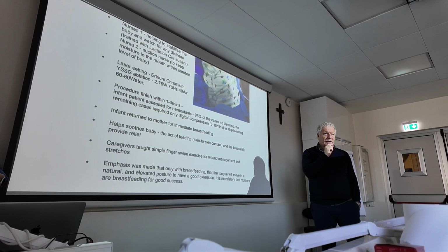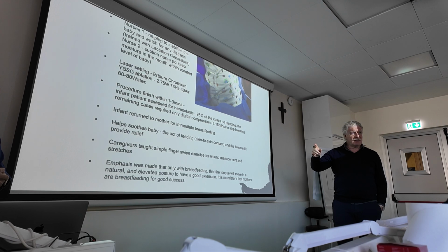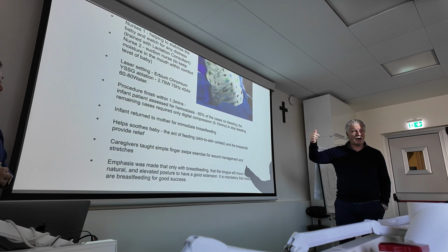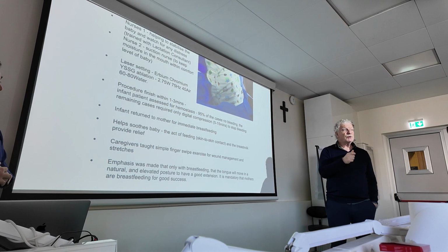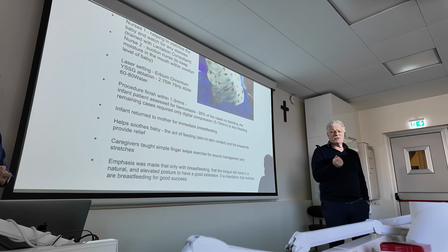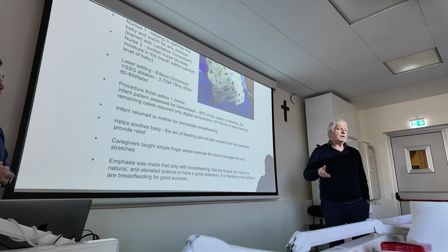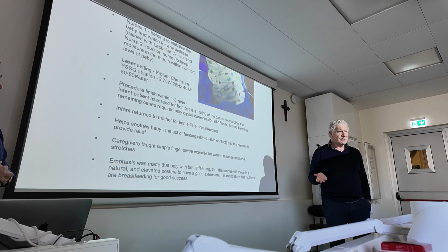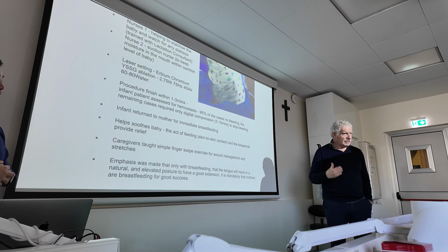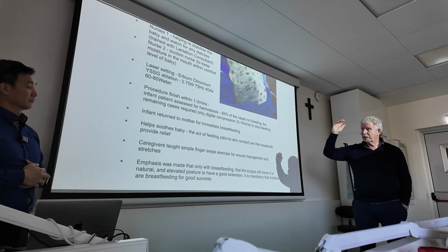So you can understand that his skill allows him to improve the power without changing the energy, because the energy is what we see is effective to cut. Then you can be slow or fast. So this energy, that is a low energy delivered very fast, is more effective with higher power.